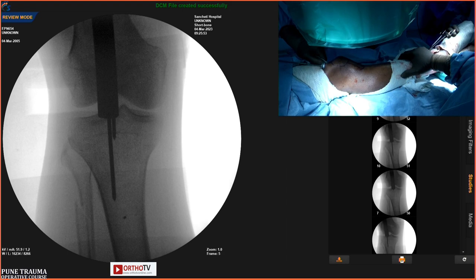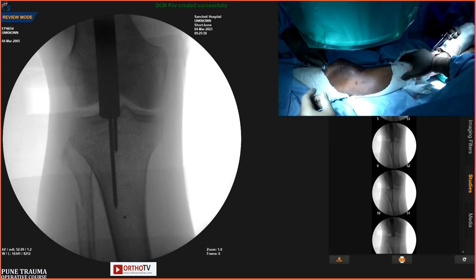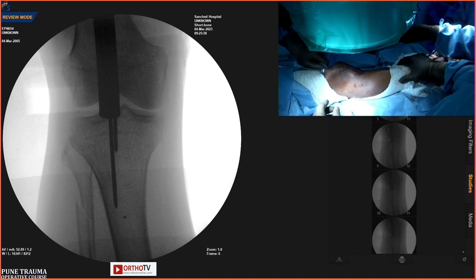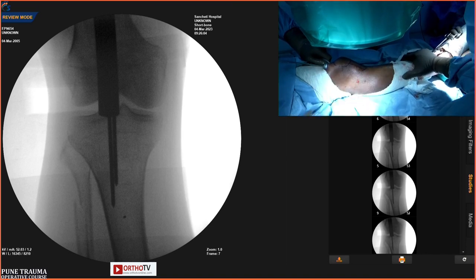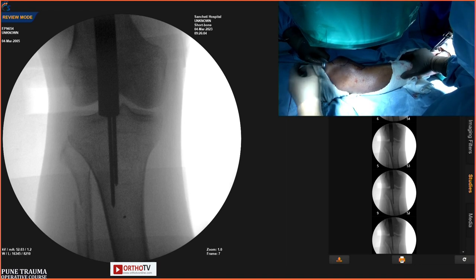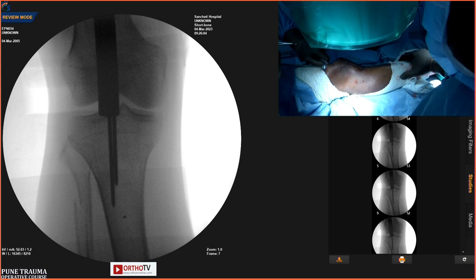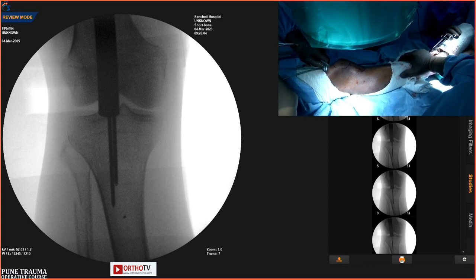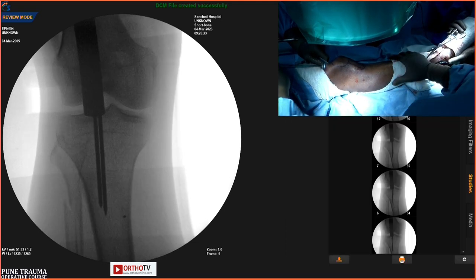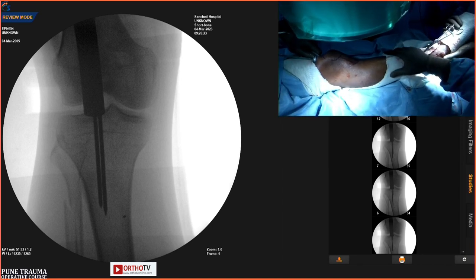Now see, okay, don't worry. Sir, you are putting lateral, this is the lateral portion, that is why. Put it on the medial side. Like here, here. No, this is medial only. It's okay. Now this is the guide wire.